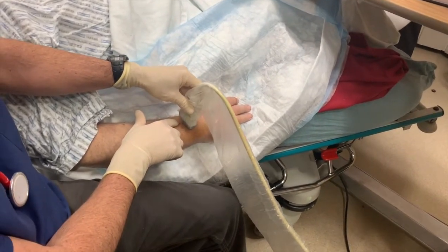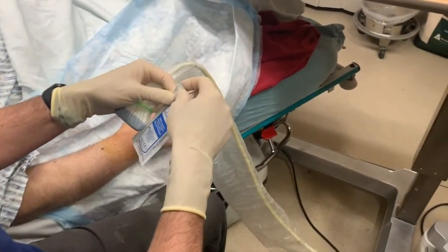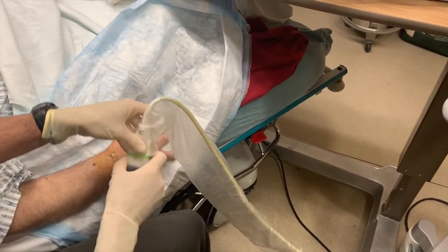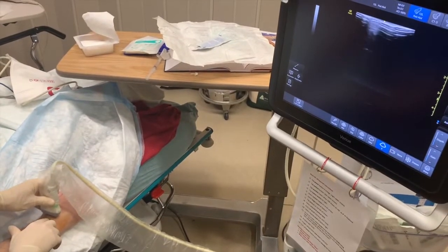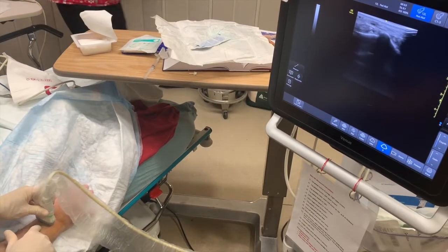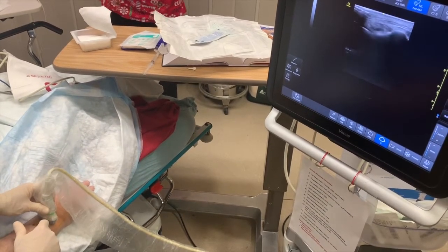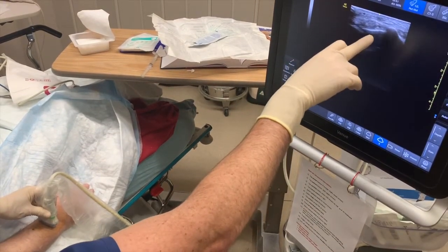I just wanted to see if I can see anything with the ultrasound. I really can't — try putting a little bit of gel on there. So I'm gonna try to go between those bones here.